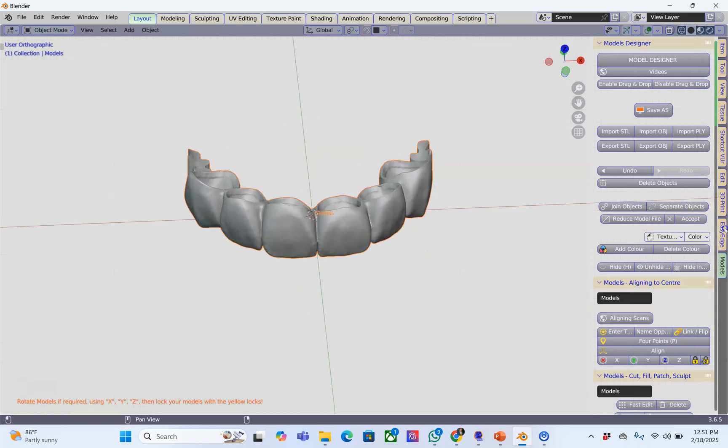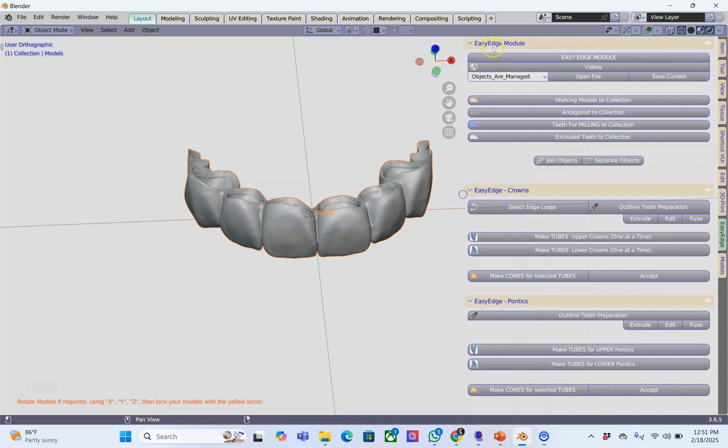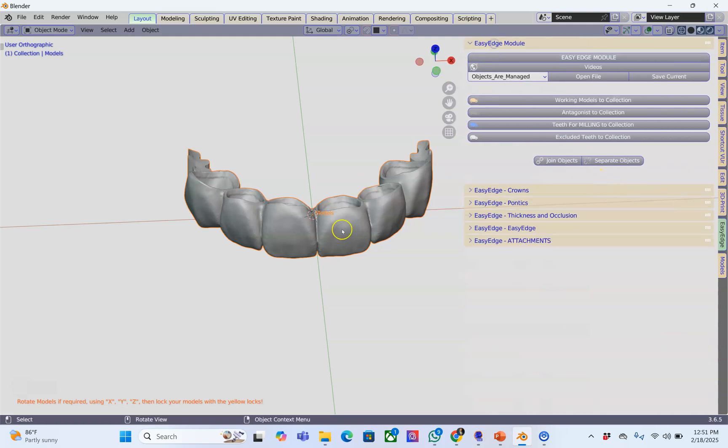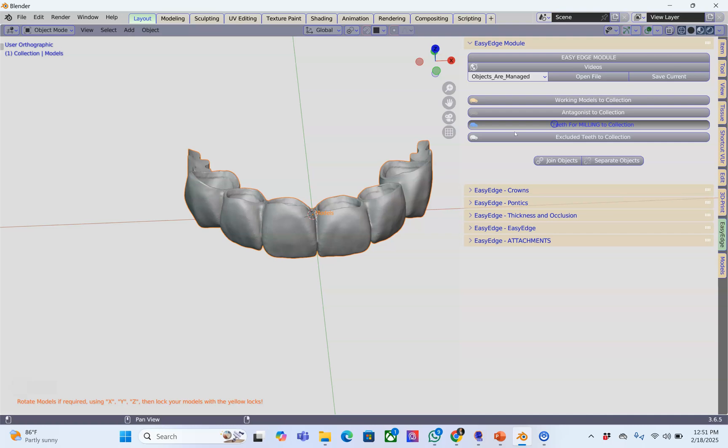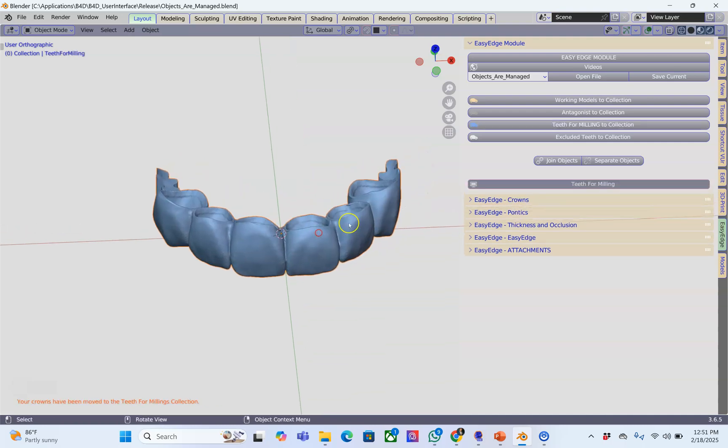I'm going to go to the Easy Edge module which is the new module that's going to be released very soon. These are the teeth. This is object management and I'm going to be using these teeth for milling.